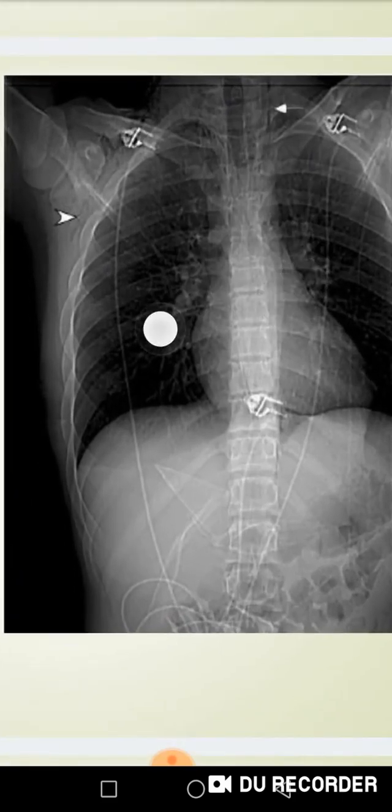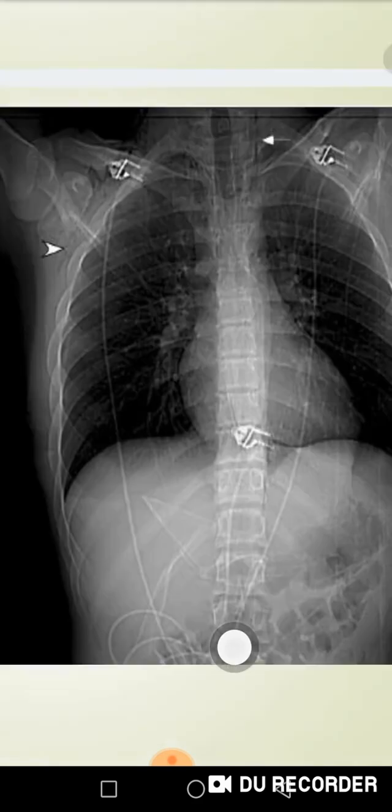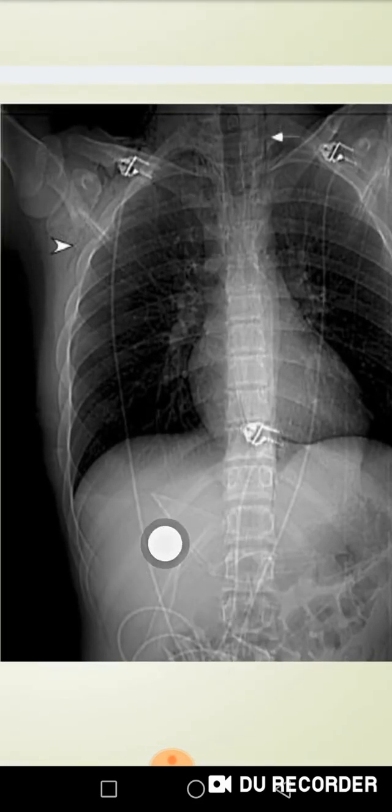In the regular X-ray image, as you can see here, the lung appears black because the lung does not have the ability to absorb the radiation. Consequently, a lot of strong X-rays pass through without absorption, so they hit the detector, resulting in darkening and the color black. However, you can see that the spine is starting to appear white. Notice the ribs. These are the ribs that appear white. Therefore, the bone appears white, while the air appears black, with gradations in the grayscale in between.